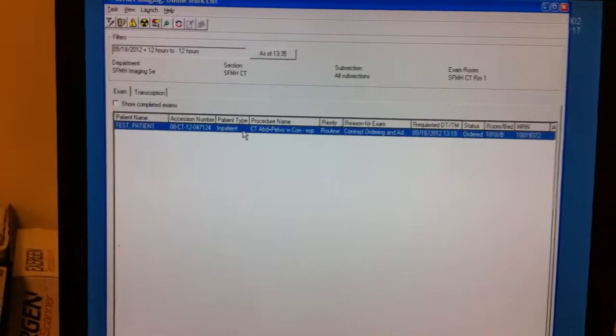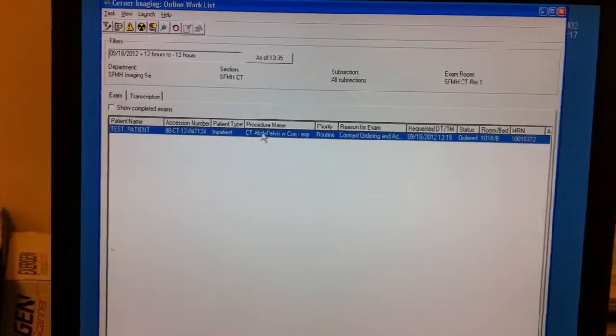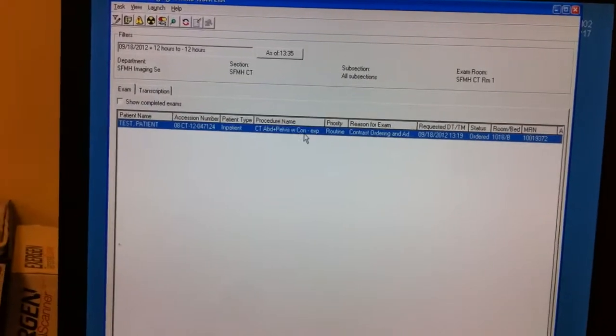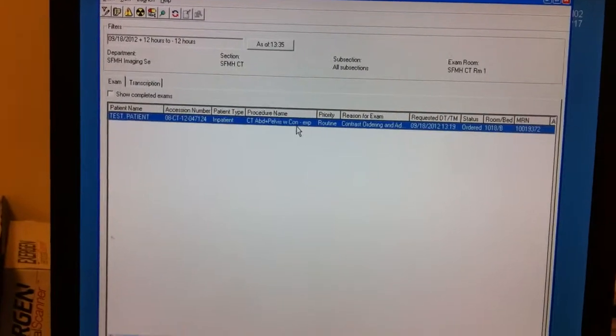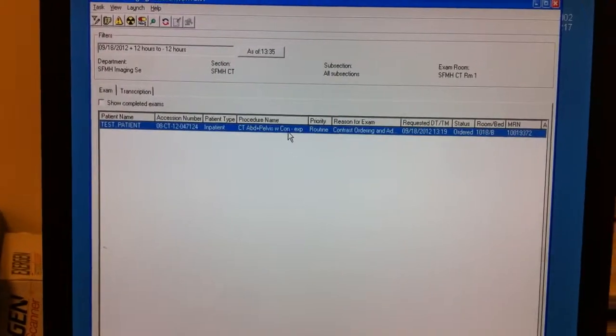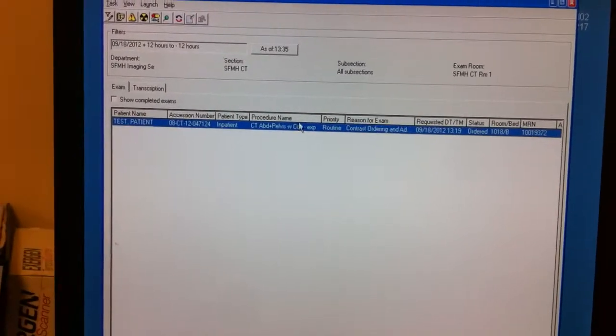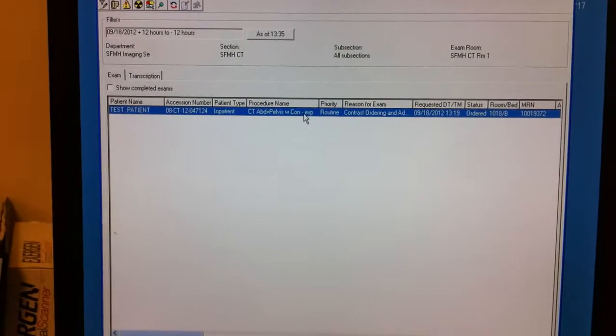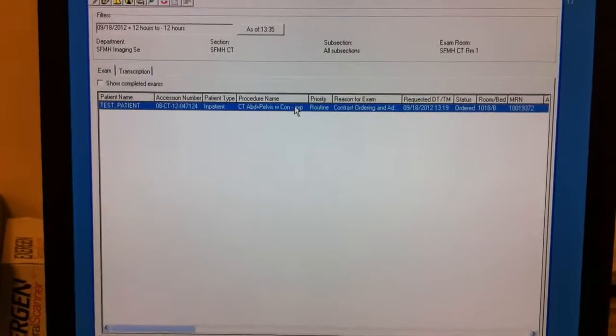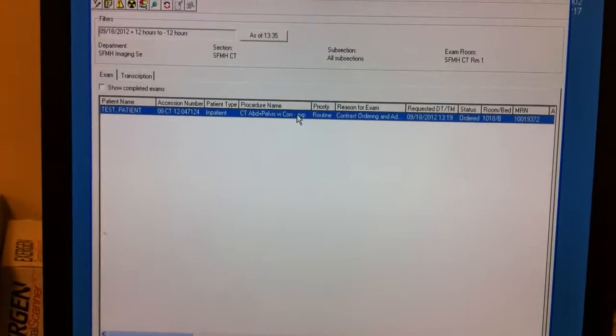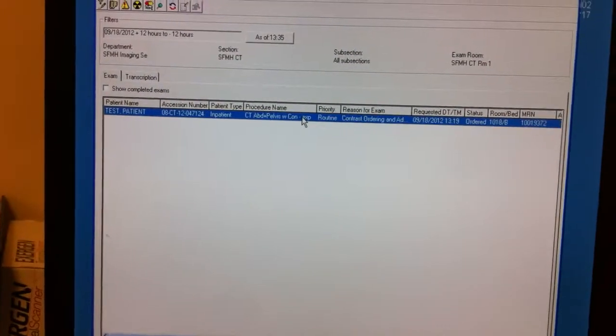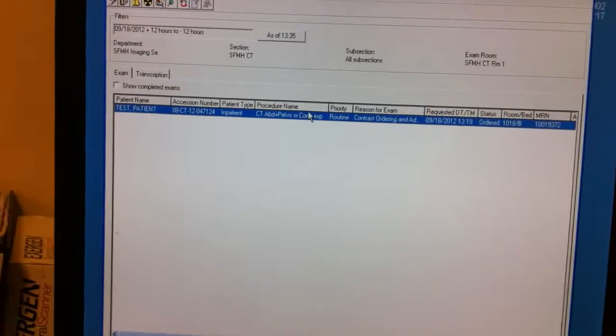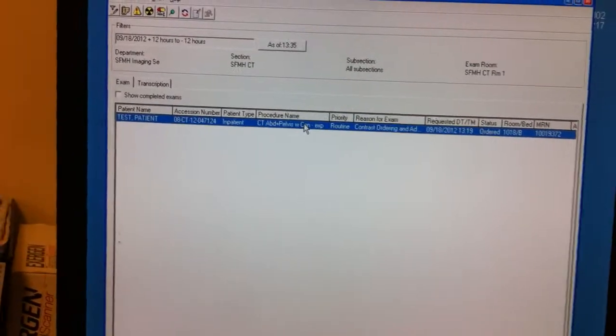And we just got this order in for a CT abdomen and pelvis with contrast. Before we begin the exam or even potentially after we start the exam, we have to document the contrast. So let's go right here.